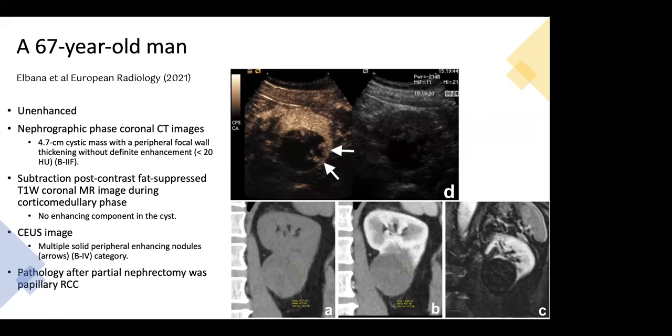It is nodular. And if you compare even on CT and MR, the appearance of this is misleading, of a benign cyst, and based on this contrast-enhanced ultrasound, one would definitely call this highly suspicious enhancement, making this most likely a category 4 Bosniak cyst.